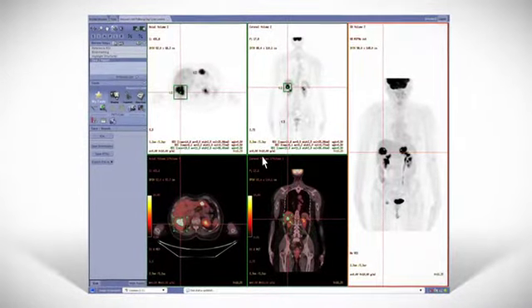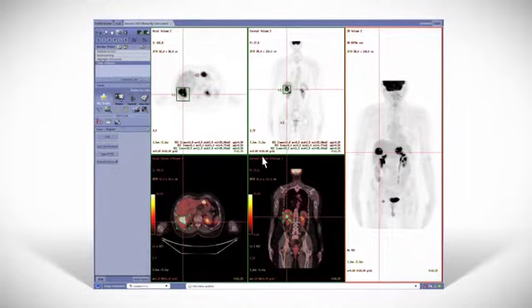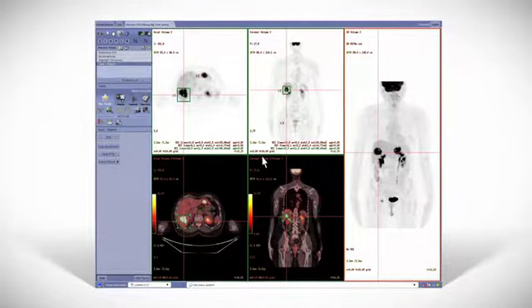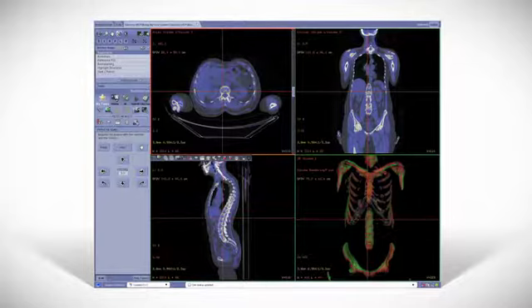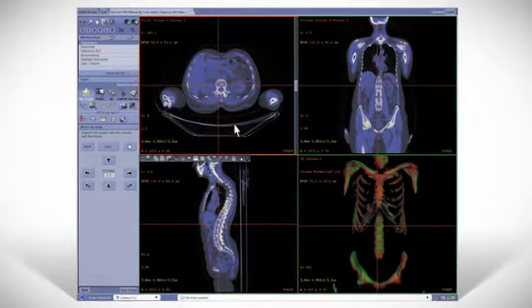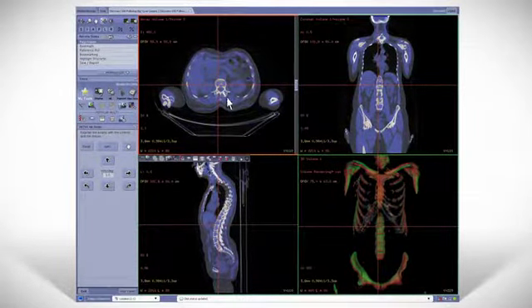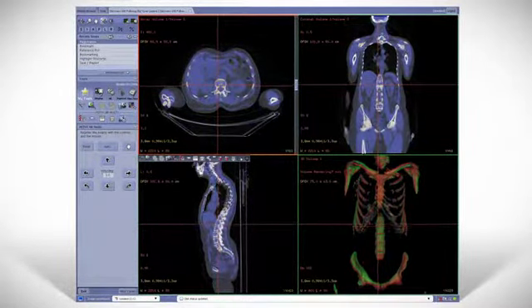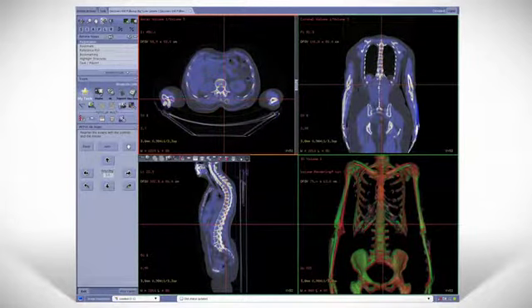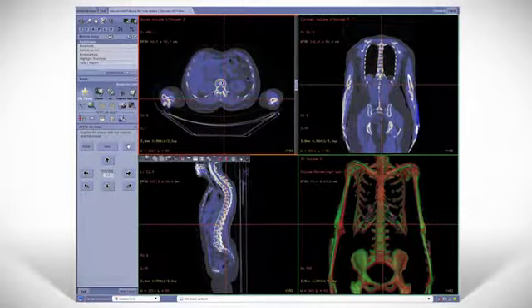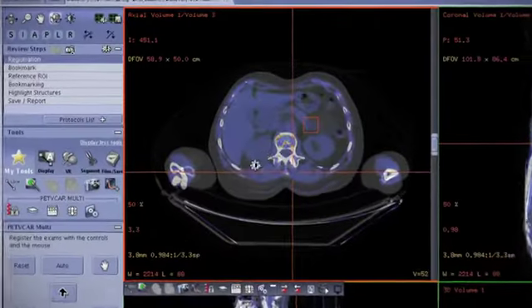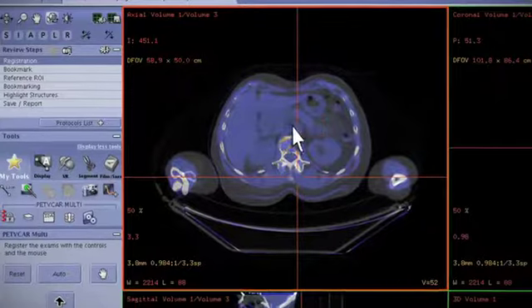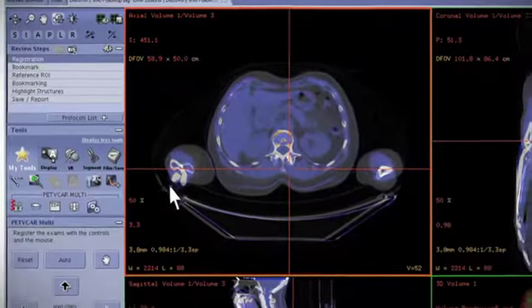This information can follow the patient through the course of treatment, which can include numerous scans for follow-up. The program also allows you to compare all of these scans to evaluate the response to treatment. Displayed on the registration screen are the baseline and follow-up exams. The application performs a rigid registration on CT datasets matching the bone structure of one CT to the bone structure of the follow-up CT.